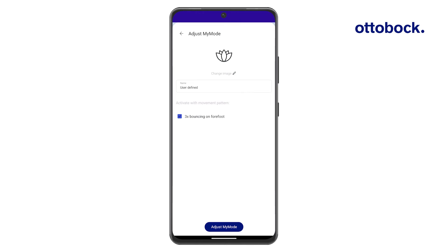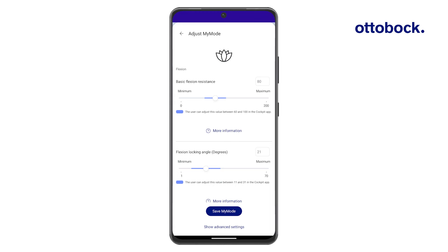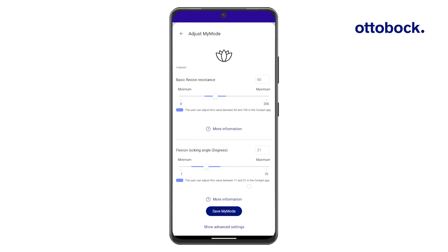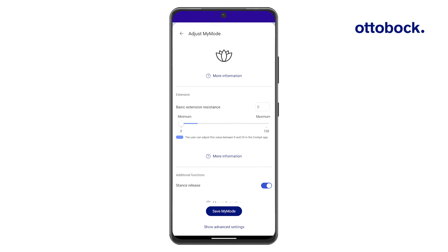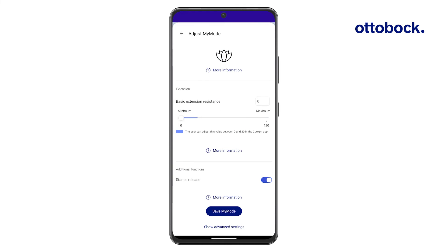To adjust the MyMode parameters, continue with Adjust MyMode. To see all parameters, press Show Advanced Settings.